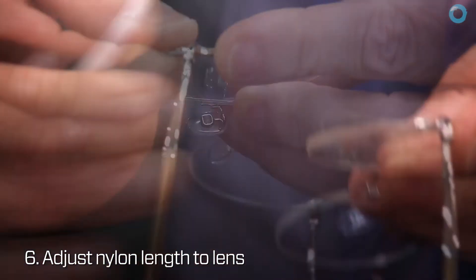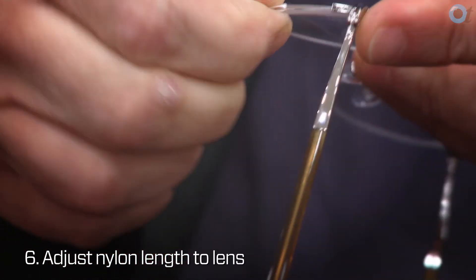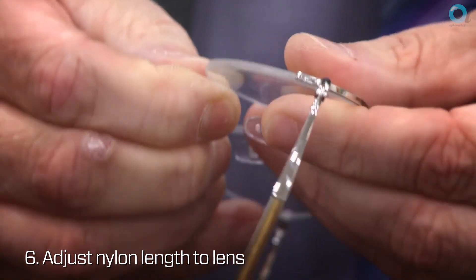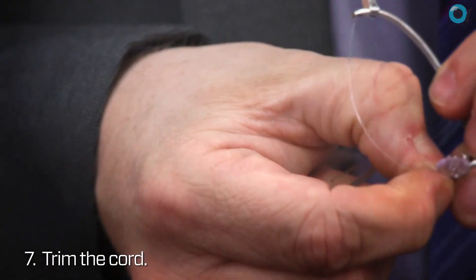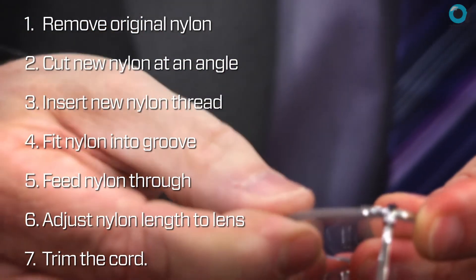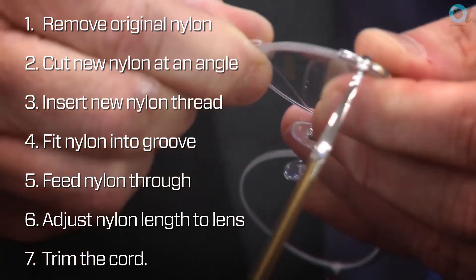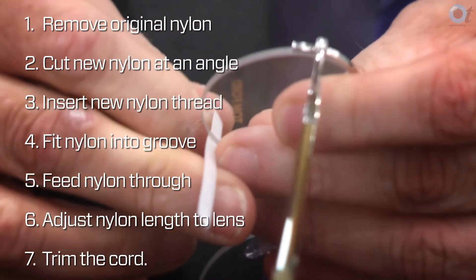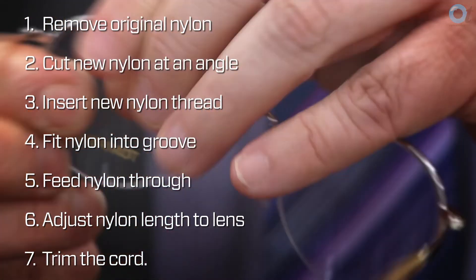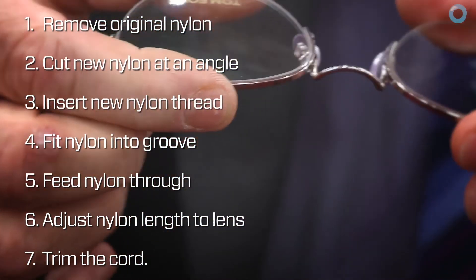With that just tucked out of the way, I'm pretty confident that the nylon will be the right length. Just by sliding the tape round, that locks in fine. Let me just take the front off and trim the cord. Offering the lens back up, move the tape — and that's the lens re-fitted into the frame with the new superchord.